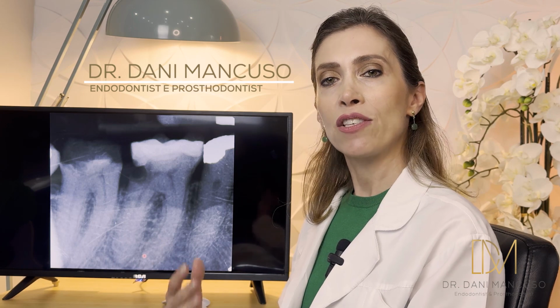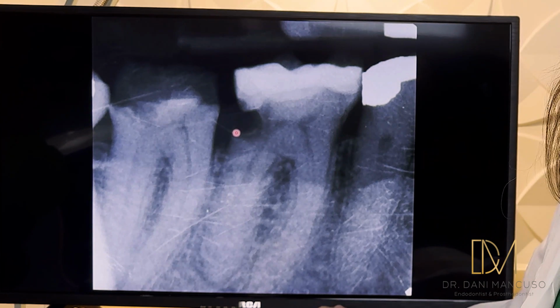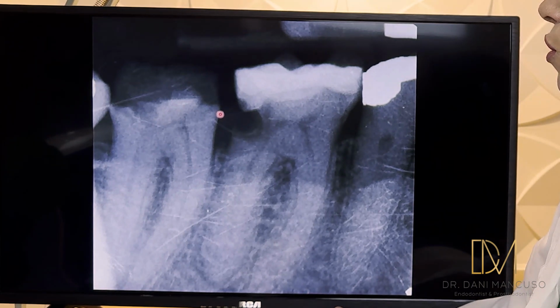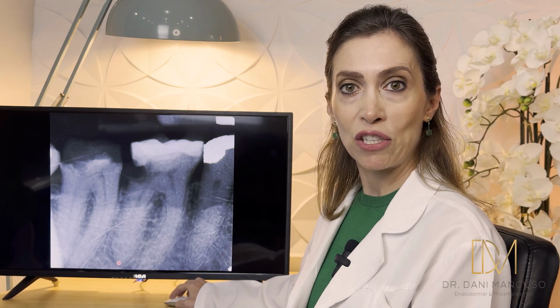Deep caries are quite common, aren't they? So it's always a doubt whether we can save those teeth or not when the caries become too subgingival. In this case, on this lower right 6, we can see quite a big cavity and it's subgingival, so the gingival margin is over there. The other tooth is also broken down and there is a possible periapical radiolucency.